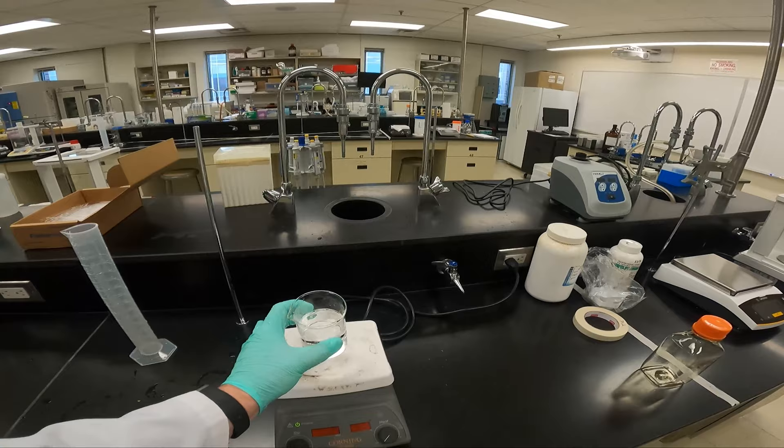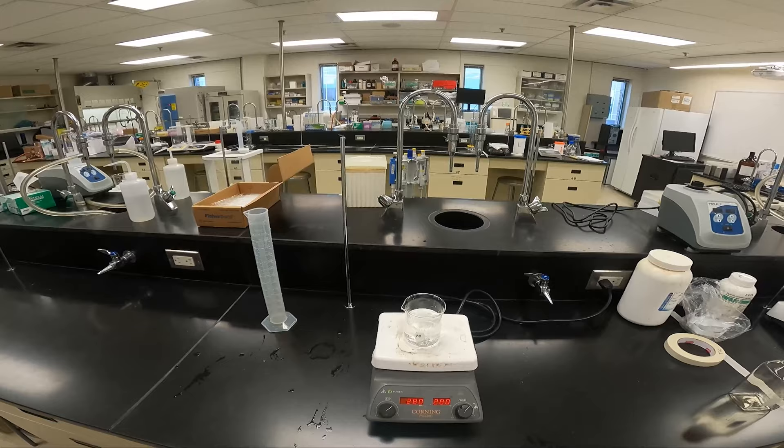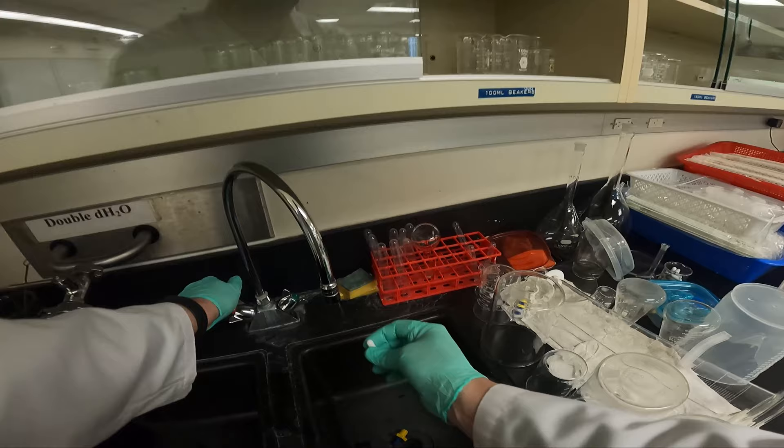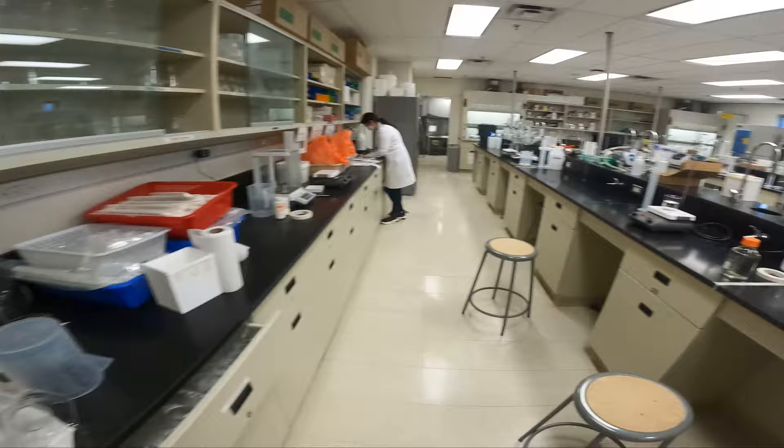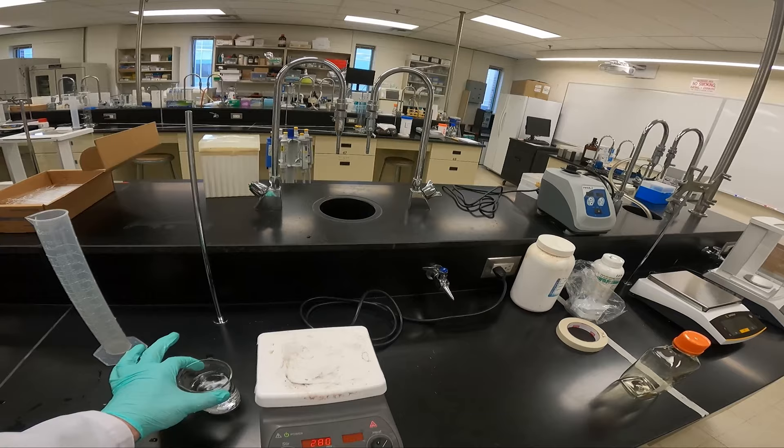Now EDTA does not dissolve at room temperature — I must heat it up. I will use the hot plate that stirs to do that. On the left I have the stir function, on the right I have the heat function. I will turn up the heat to warm it up and I will turn up the spin to about 300 RPMs. I will use a magnetic stir bar to help dissolve the EDTA — make sure I rinse it and place it inside. Don't go faster than 400 RPMs; you'll end up spraying liquid all over the lab.